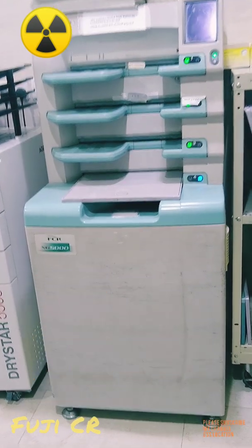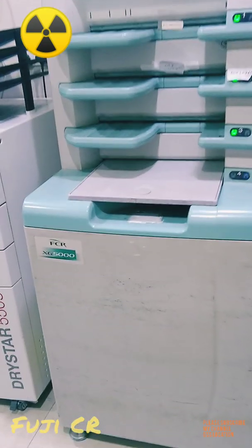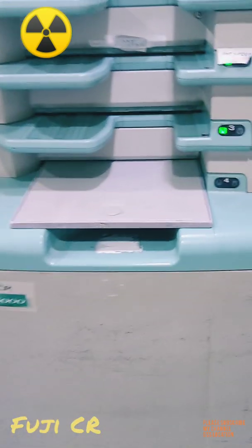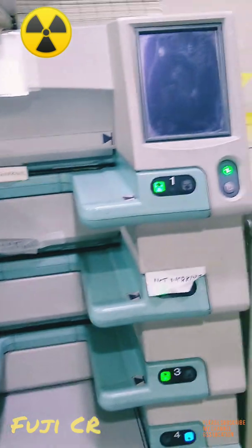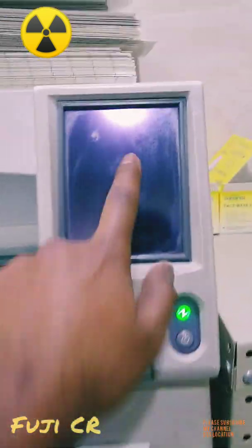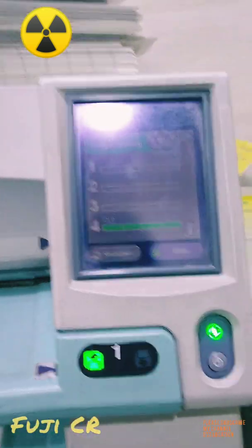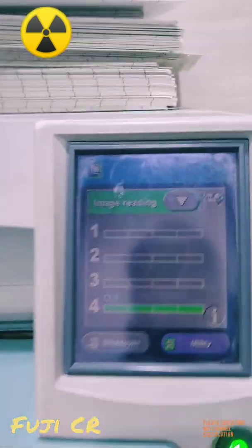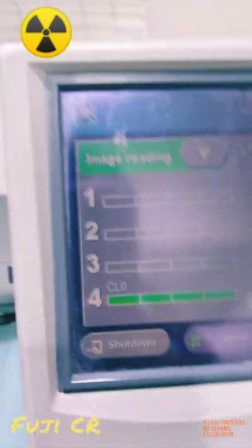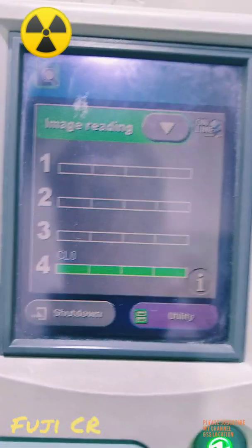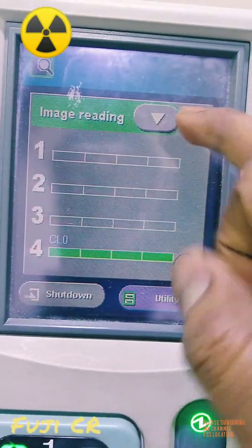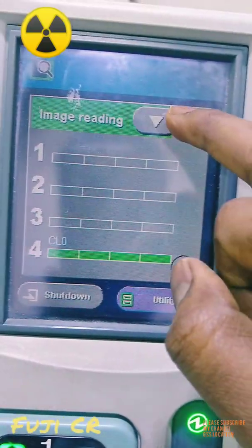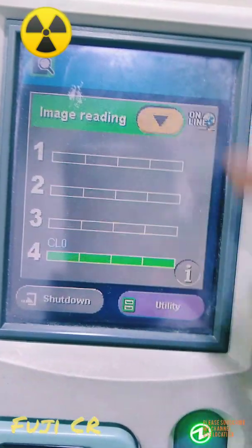Hi, hello everybody. I am going to show you the DX 5000 Fuji CR. I am going to talk about how to transfer the image if you have made any mistake.